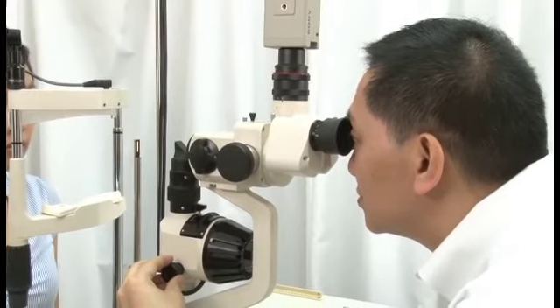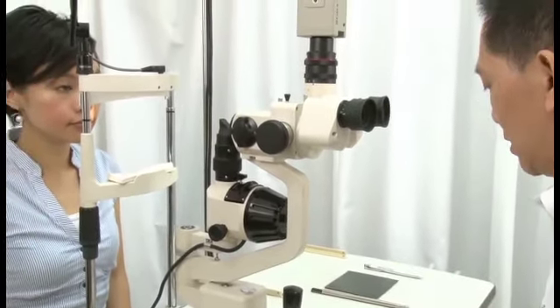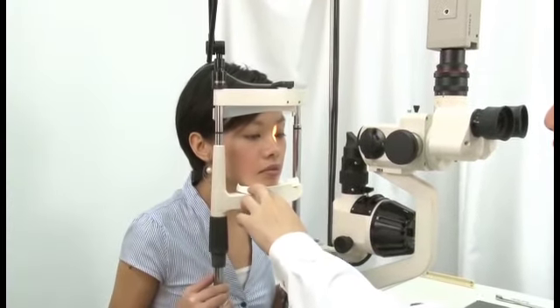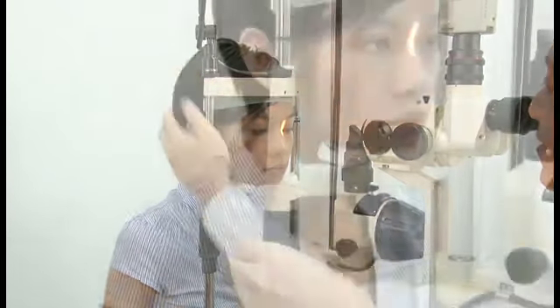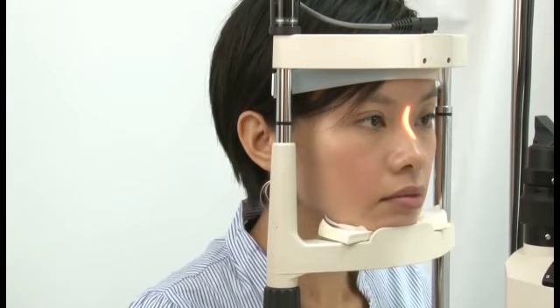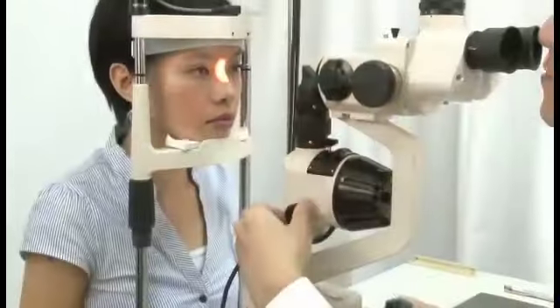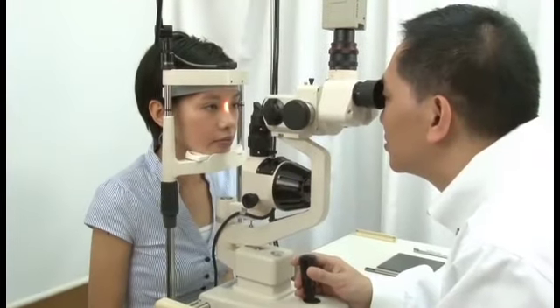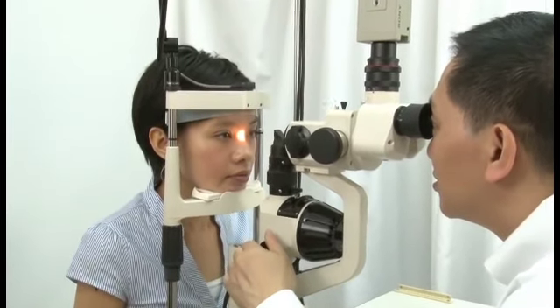In preparation for patient examination, make sure they are seated comfortably. After seating the patient, adjust the table to a comfortable working height. Position the patient against the chin and forehead rests, and adjust the instrument so that the index mark on the chin rest set assembly aligns with the outer canthus. Before starting the examination, set the rheostat to its lowest level before turning on the power.